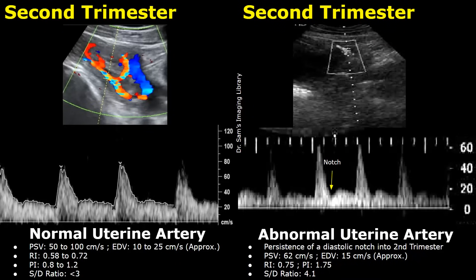Here is another example of an abnormal uterine artery spectral Doppler waveform. We see a diastolic notch right here. The resistive index is slightly raised at 0.75. The pulsatility index is also raised at 1.75, and the SD ratio is also increased at 4.1.